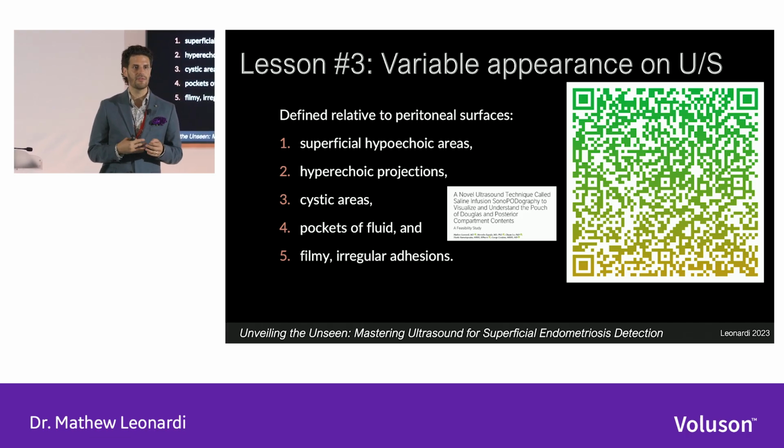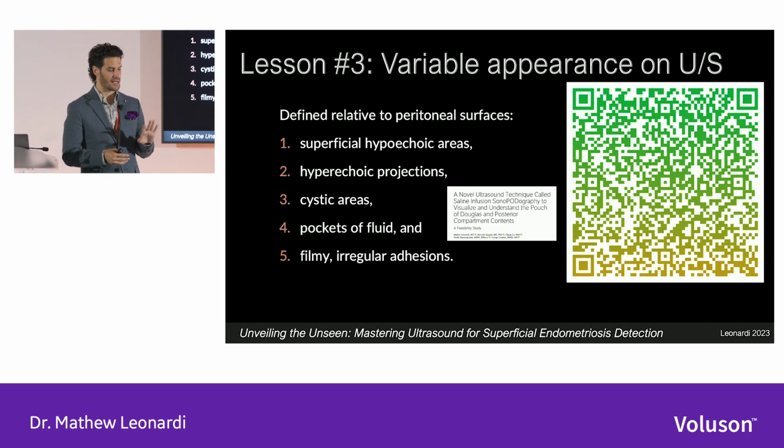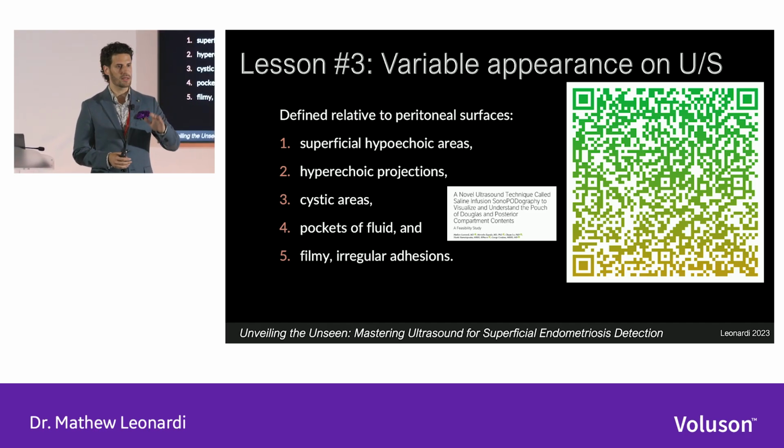And then finally, filmy irregular adhesions. Sometimes this is aligned with peritoneal pockets, and sometimes this is distinct. And you can see this when things are floating. They're sort of flapping in the fluid.